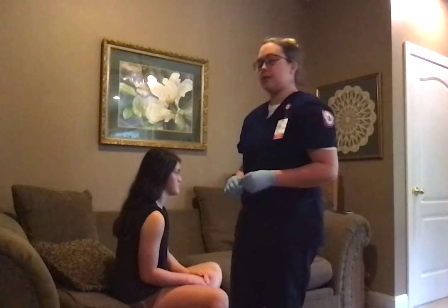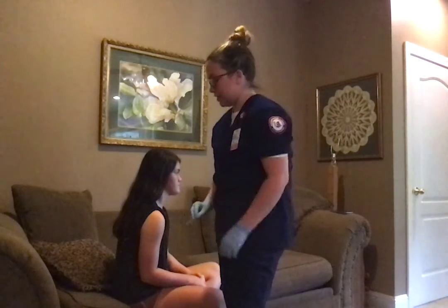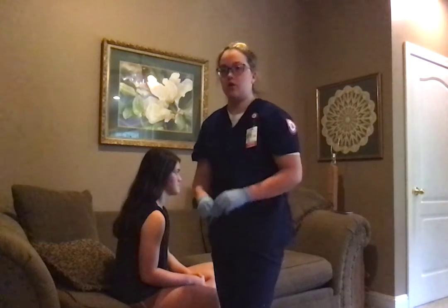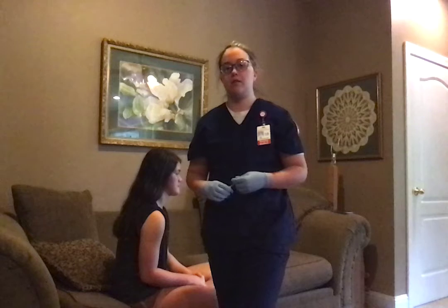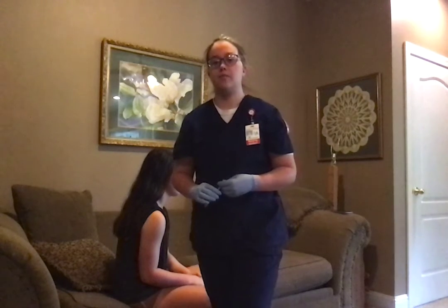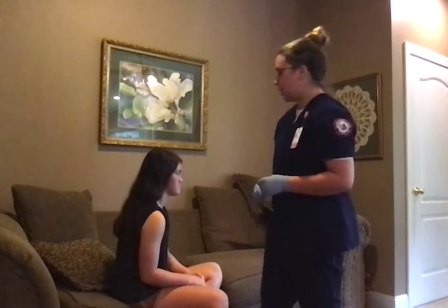This is a subcutaneous injection site, so I could either inject at a 45 or 90-degree angle here, depending on the amount of subcutaneous tissue present and also the length of my needle.